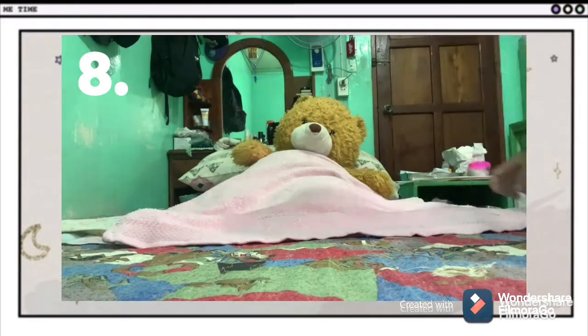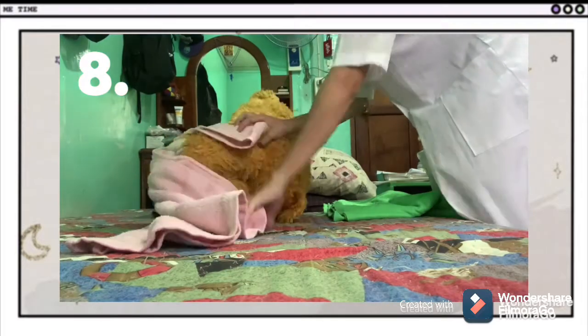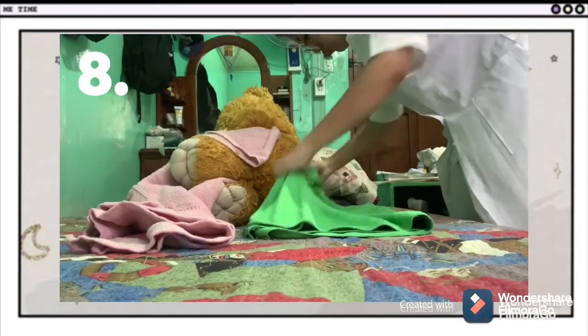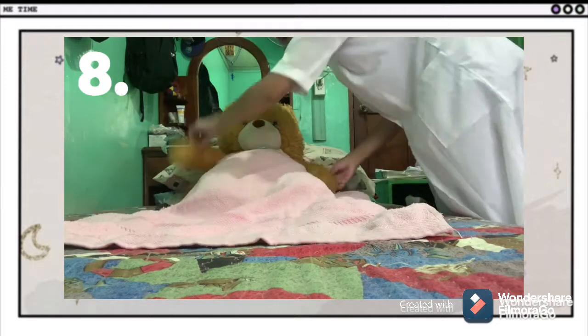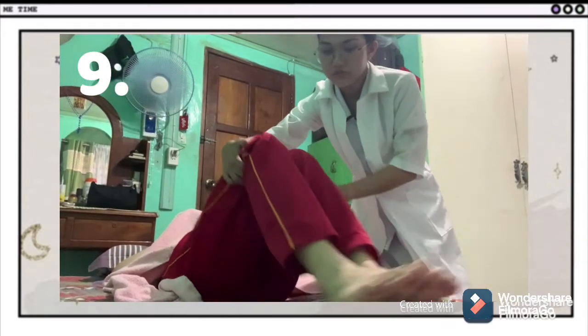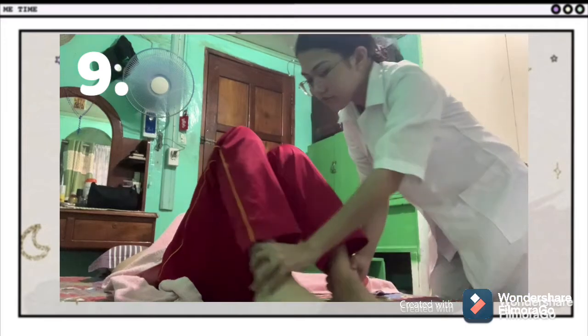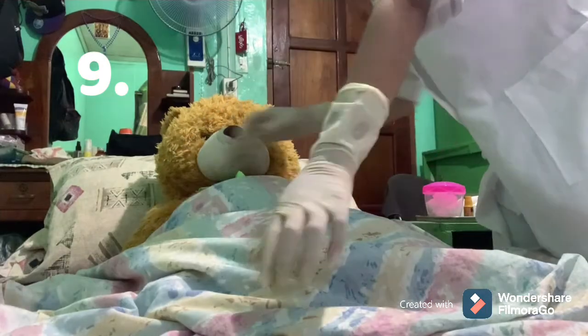Replace top sheet with bath blanket. Place waterproof underpad under the client. This protects the bed linen from moisture and getting soiled. Place client in a dorsal recumbent position and drape client. Good visualization of the meatus is important. Embarrassment, chillness, and tension interfere with the introduction of the catheter.